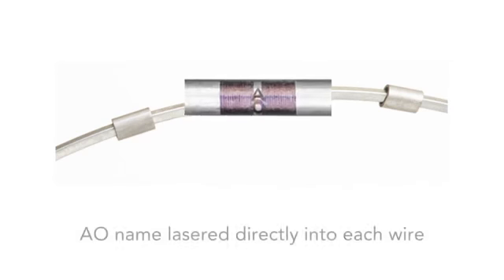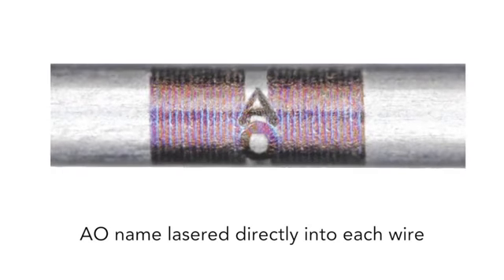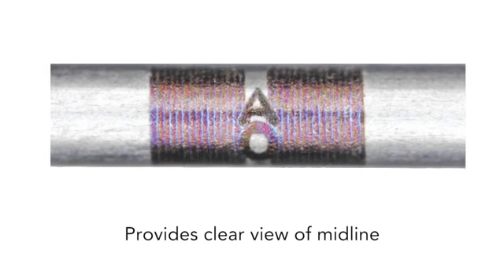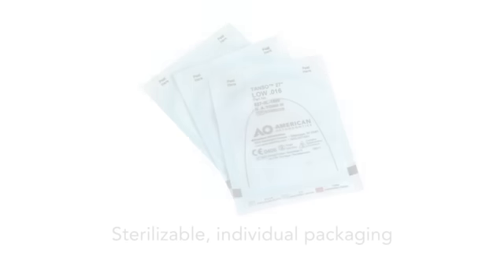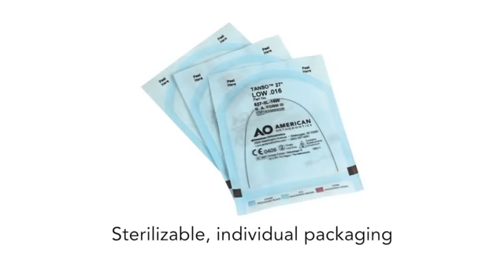The American Orthodontics name is lasered directly into each wire. This industry first provides you with a clear view of the midline and lets you know that your patient is receiving a quality product with every TANZO wire. TANZO comes in sterilizable individual packages to enhance safety and eliminate cross-contamination.